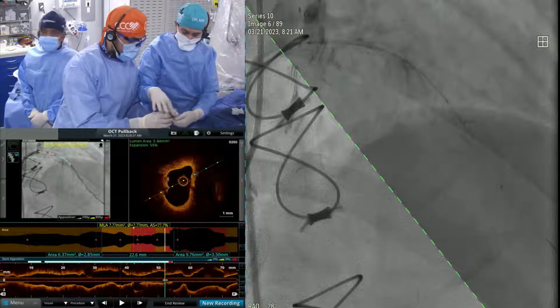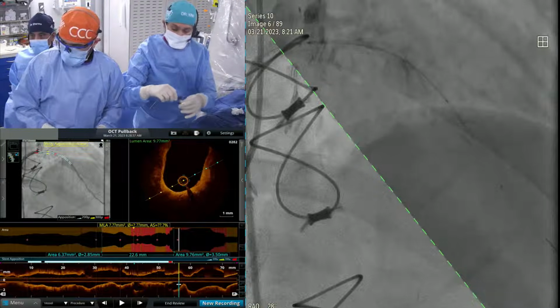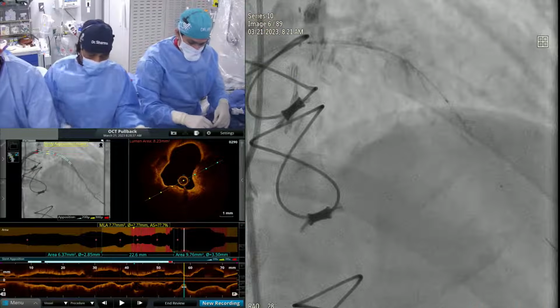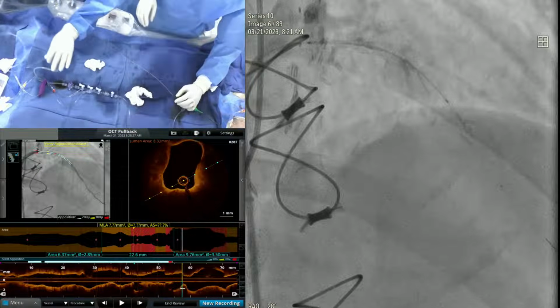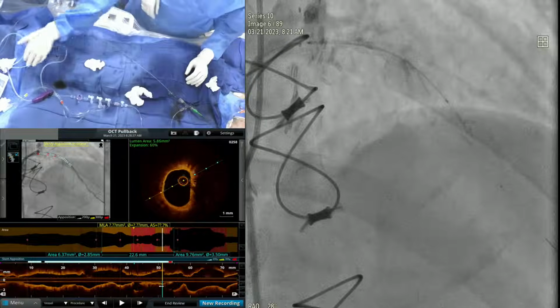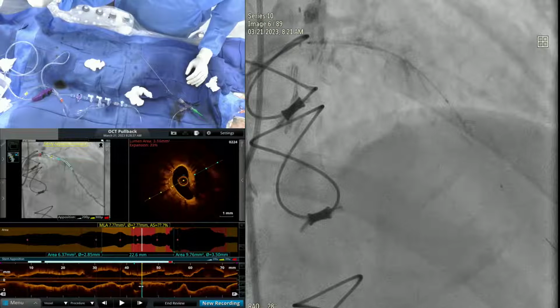So in this area, anyway, our goal is, because of calcium and because of unexpanded stent, to ablate it with the atherectomy, and then we'll go to the next. Dr. Sharma, the distal left main area is more than 8. It's more than 8. Okay. So left main is not significant. Good. Balloon, give me a 3.5, 3.5 by 30. Okay, 20.